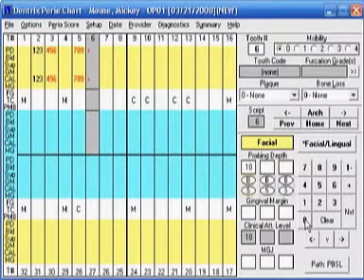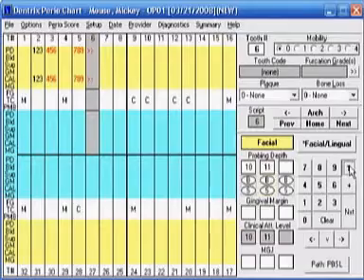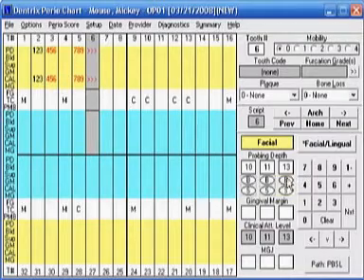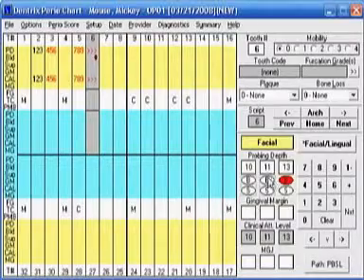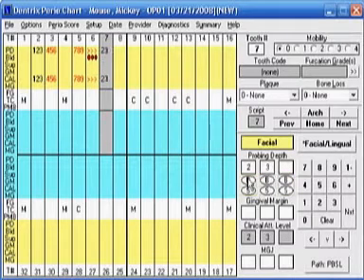Now let's say your next pocket is an eleven millimeter pocket. Go to one dash and then enter the one from your Dental Rat. If you have a thirteen, do the one dash and enter the three from your Dental Rat. You can also mark bleeding at the same time by taking your mouse over to the B and rocking back with your heel on the bleeding. So you can quickly mark perio and bleeding points at the same time.